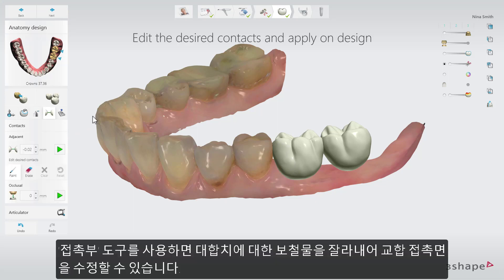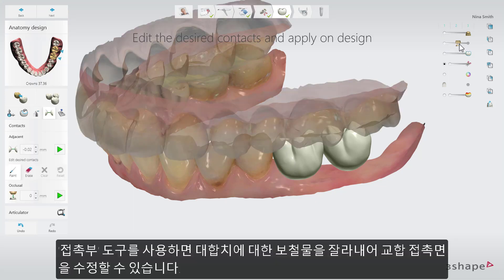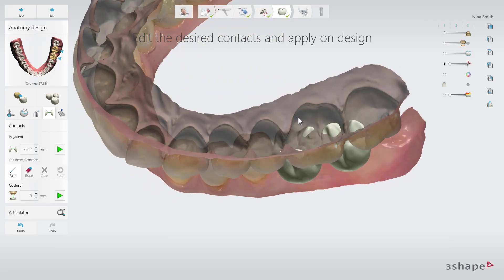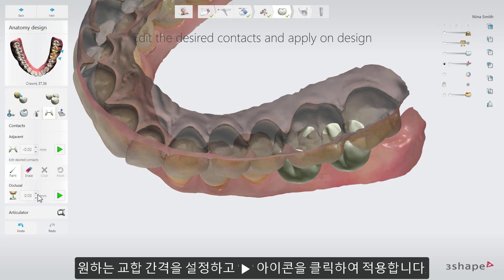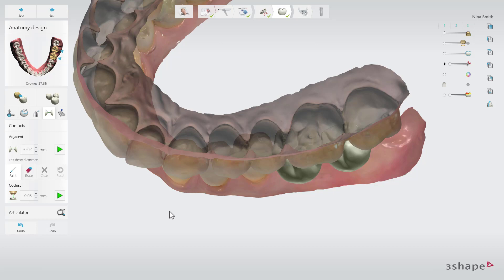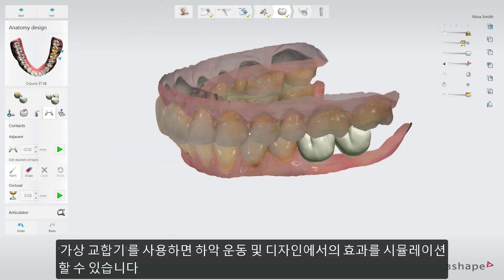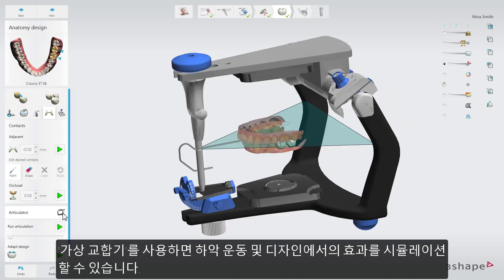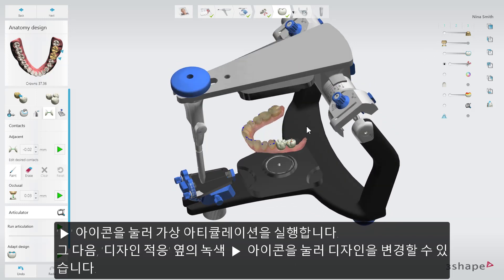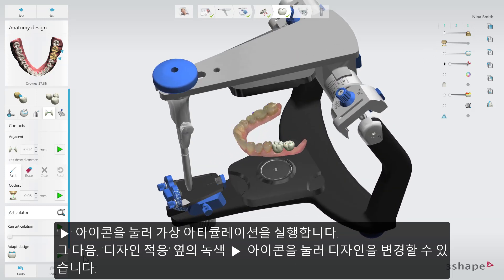Use the Contacts tool to correct the occlusal contact by cutting the restoration to the antagonist. Set the occlusal space you want and click the Play button to apply it. You also have the possibility to use the Virtual Articulator to simulate dynamic articulation of the jaws and its effects on the design. Run the virtual articulation by pressing the Play button. After that, you can adapt your design by pressing the green Play button next to Adapt Design.